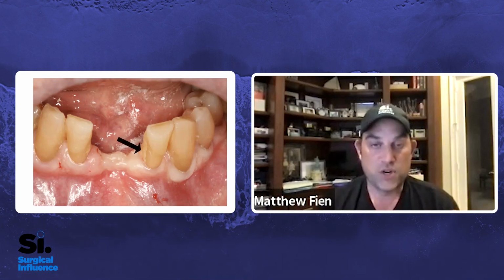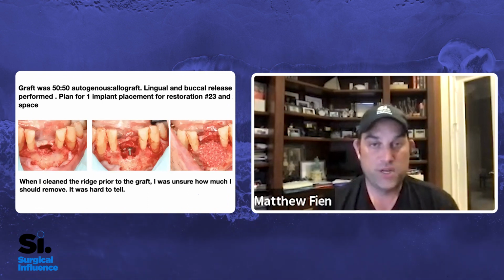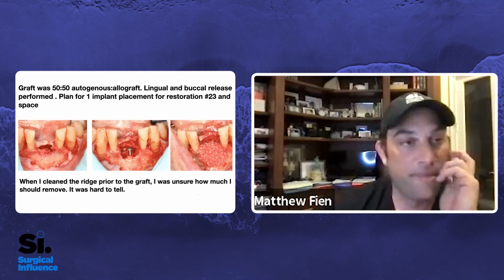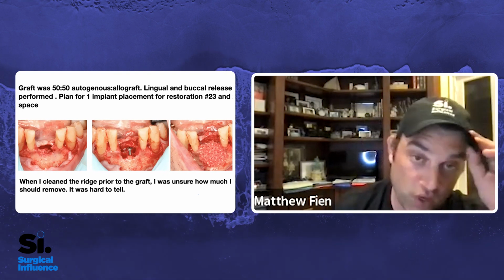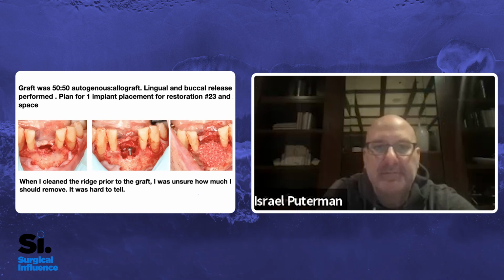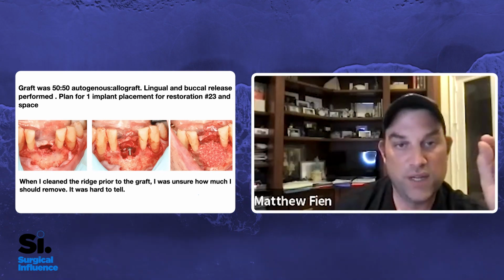And the way this was treated, you'll see here, this is the pre-op of the GBR. This was actually treated with a tenting screw. So this person obviously follows Israel on Instagram because he knows that in order for us to maintain that vertical height, we need some sort of space maintaining device. I think I've seen a case of yours very similar to this, where you use that tenting screw beautifully.